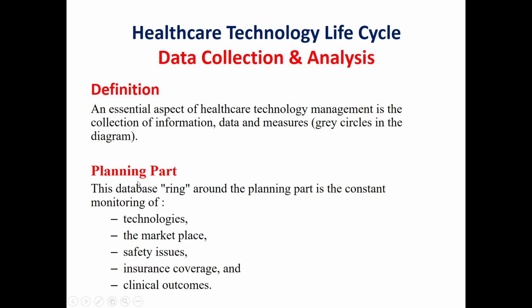In the planning part, the data collection will be the constant monitoring of the technologies. The marketplace, what we mean by the marketplace is the available brands and so on. The safety issues, in case we have hazard recalls and alerts, insurance coverage, and clinical outcomes. So we should always make a collection of data and analysis in the planning part.